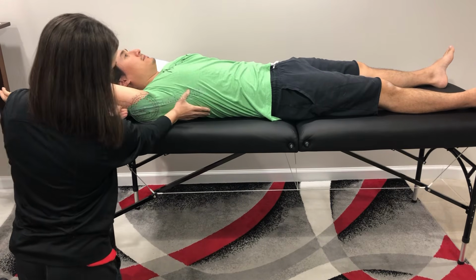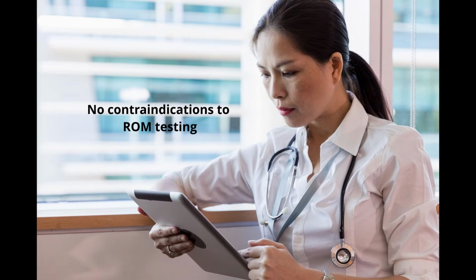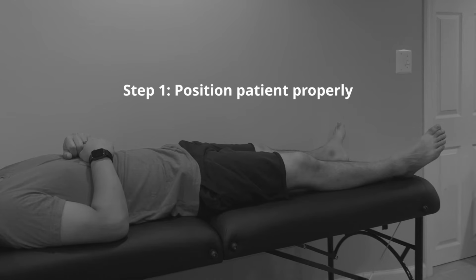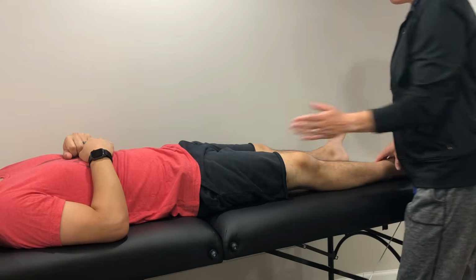So let's go over the steps necessary to take a proper measurement. As with any procedure in physical therapy, the first step is to make sure you're safe to perform it. Once that's been done, you want to introduce yourself to your patient and explain the testing procedure. After getting patient consent, you want to place them in the proper standardized testing position. Next, be sure to properly stabilize the proximal segment.